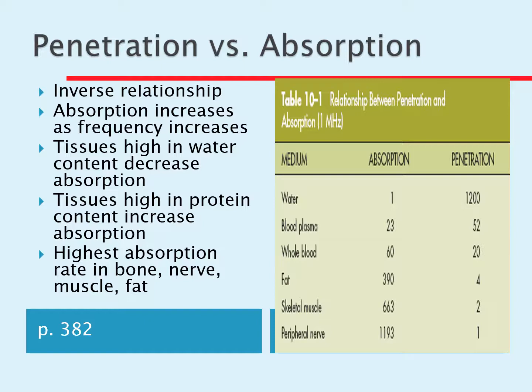And this is important, especially looking at this nerve factor here, which is right down here. Because again, when you do ultrasound, if you should hit over one of the nerves, your patient will let you know it hurts.